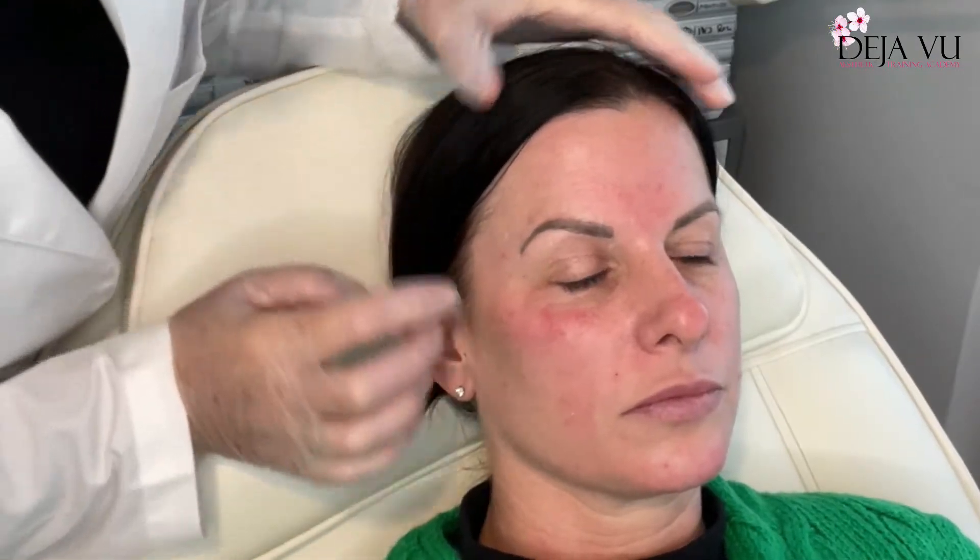Before I start, we can already see the difference with Karen's cheekbone and her tear trough — she hasn't got as many lines there as she has here. This side is filled out more, and if you look, you can see I've done the nasolabial — there isn't a line there now, but there is a line on this side.